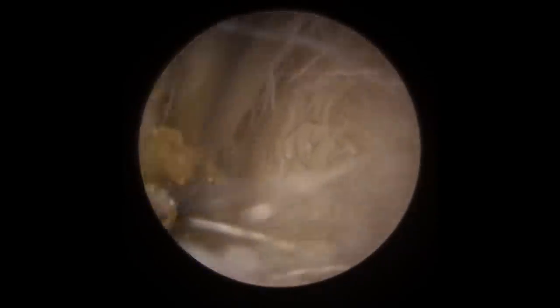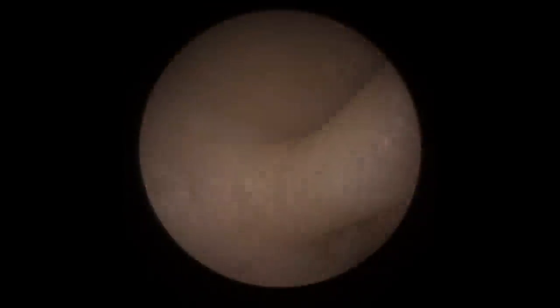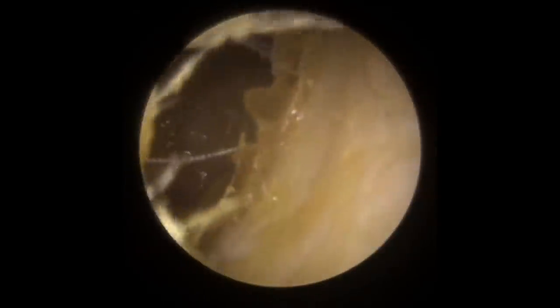I'm not going to go into the canal - I'm going to work on the outer part of the ear canal. You can see it stretching out in this long, sticky ribbon of wax and skin all coming away. I'm trying to get it out in one piece just because I know it's going to be more comfortable for the patient. Unfortunately, it's just sheared off there, so let's see if we can get another grip on it. Lots of wiggling involved in this one just because the wax is so sticky that as soon as you start taking it out of the canal, it's just going to start sticking to those opposing canal walls. Another ribbon came away there and now we're starting to go in a little bit deeper.